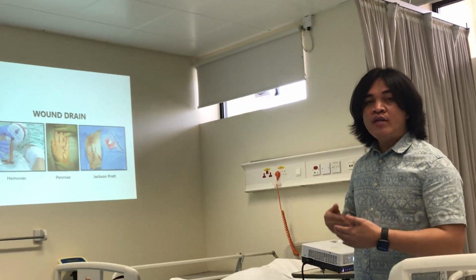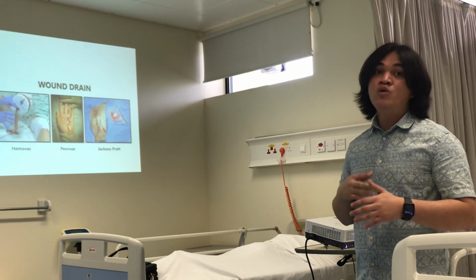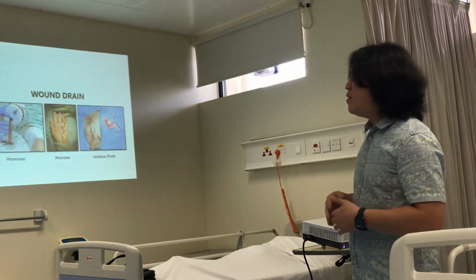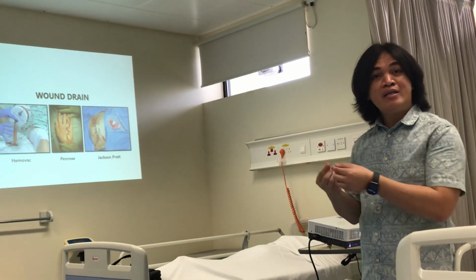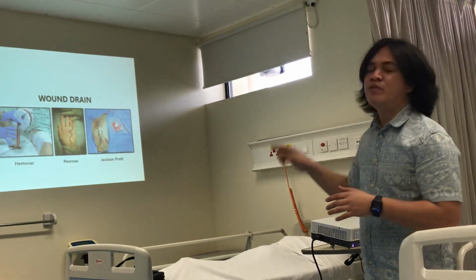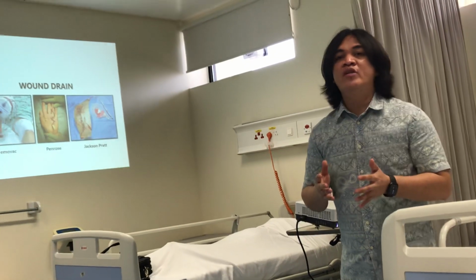To remove excessive exudates in the wound area, or else the wound will not recover if the exudate is very high. Okay? Maybe you can discuss a few nursing interventions on how to maintain this one. The negative suction should be maintained. But the higher level of knowledge on wound drain, don't discuss it anymore. The basic only, for their level.